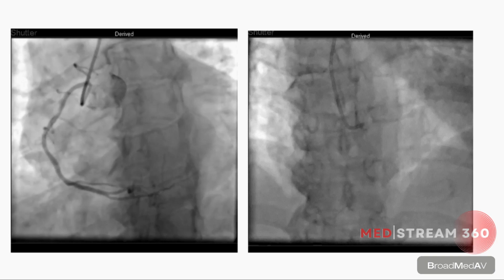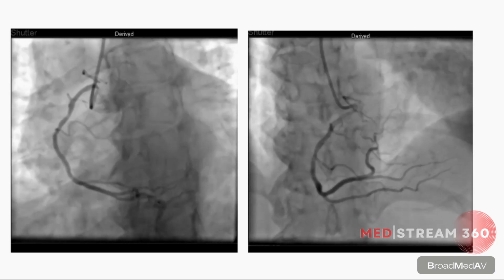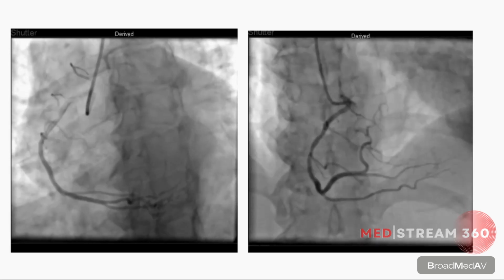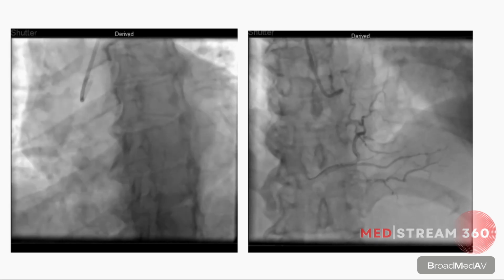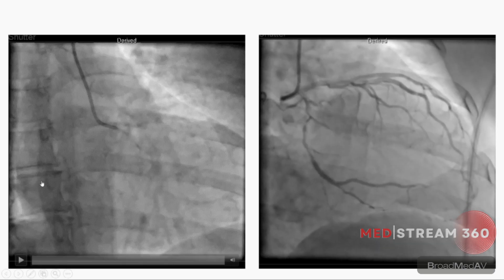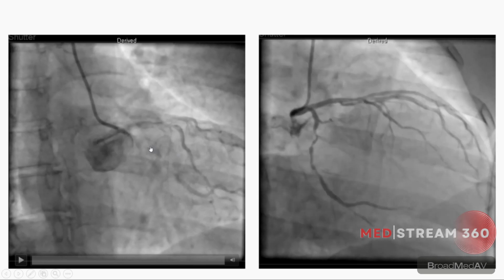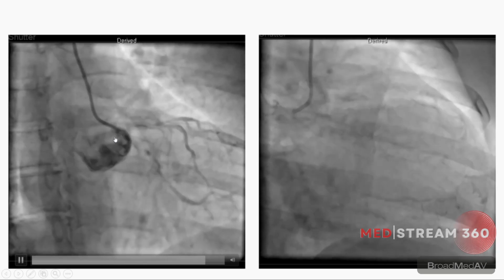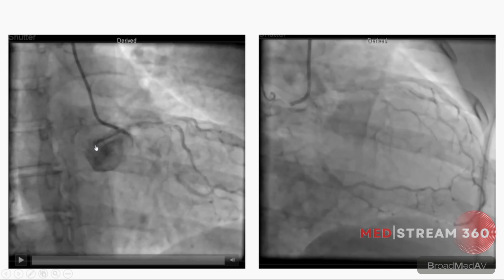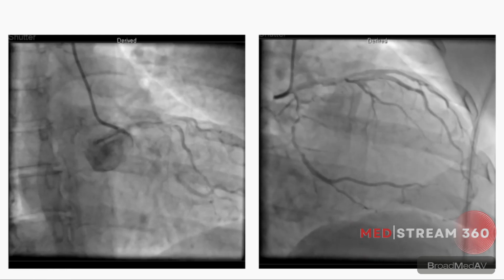So this is the angiogram through the radial using 5 French TIG. We can see the RCA is anomalously arising a little anterior and a little above from the usual position. And this is the left. If you see here, again the anomalous origin of the LCA, we can see it is far away from the expected area. In fact, at the sinotubular junction, a little above and more anteriorly.